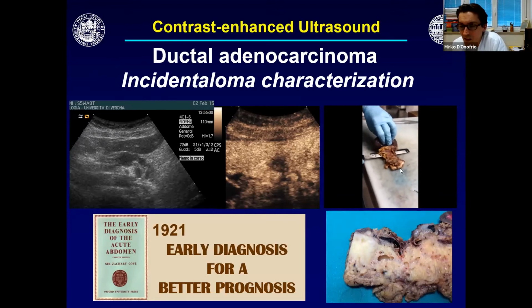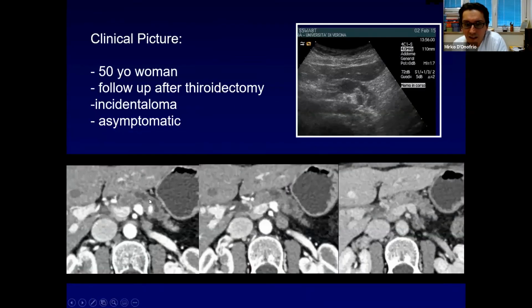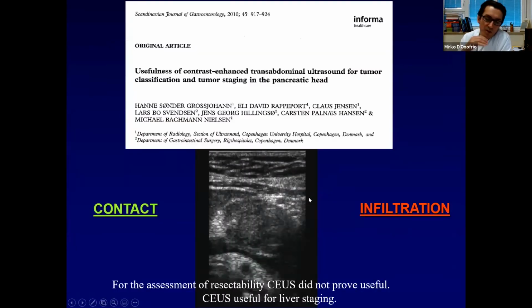The lesion is perfectly inside the pancreas once again, as you can see. Let me show you again that the lesion was not per se detectable on CT. The use of contrast does not add information for the local staging. So this is a lesion well detectable by using B mode, and the lesion is infiltrating the vein. So I inject contrast only to characterize the lesion.